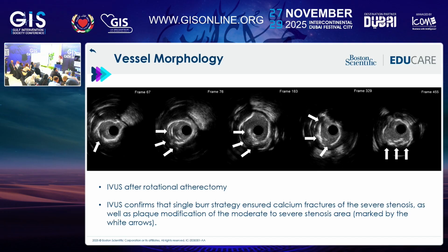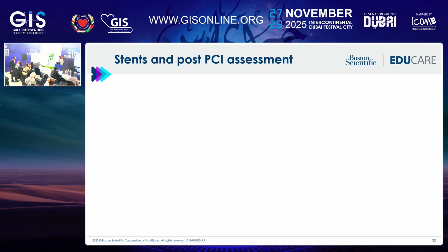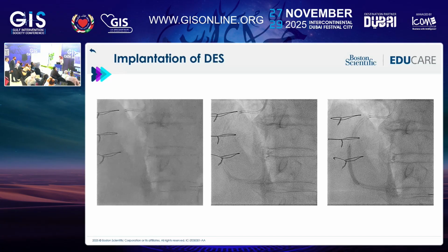So now you pre-dilated. You are ready to choose a stent. What stent should we use here? The length is 99. I'm not going to bring the drug-eluting balloon argument because there's an argument for that. But let's say you want a stent so we can demonstrate the post-processing for the PCI with the stenting. Is there any stent that is more than 90 millimeter? So we have to use two stents, a 2.75 at the end and a 3.0. We're going to go over now the angiographic result, and I'm going to see, just one second.